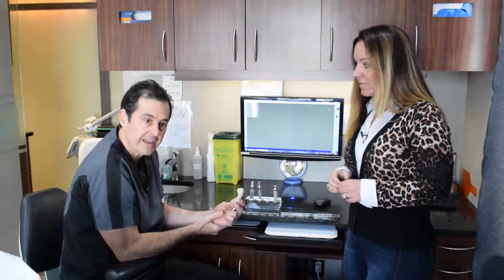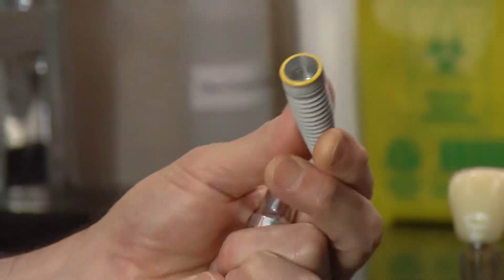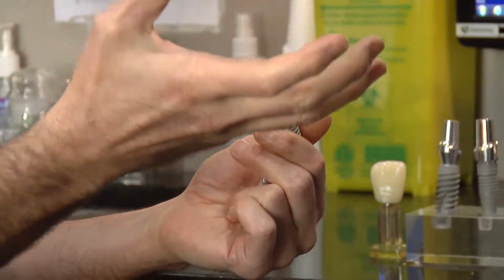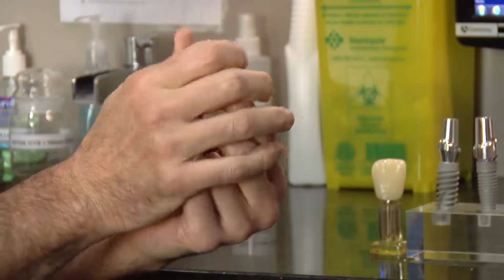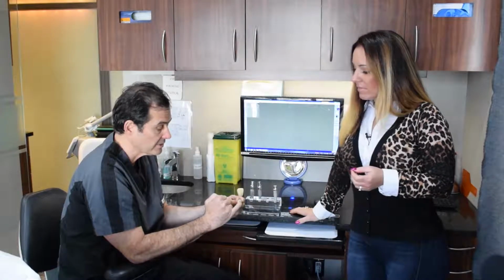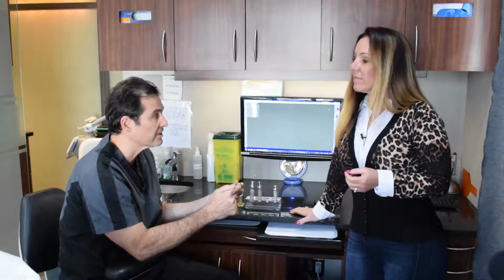We can use implants to do a lot of different things. My analogy with these is they're a lot like those anchors you put in the drywall when you want to hang a picture or something. That's what an implant is. It's hollow in the middle. We screw this thing into the jawbone and then we can put different things on top.